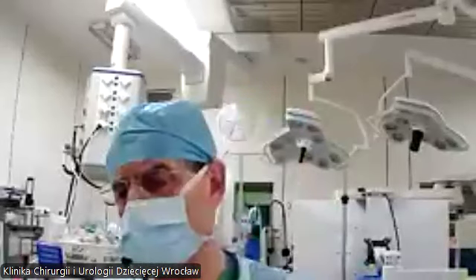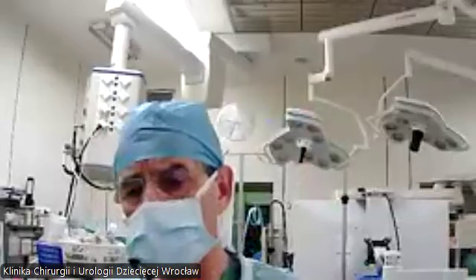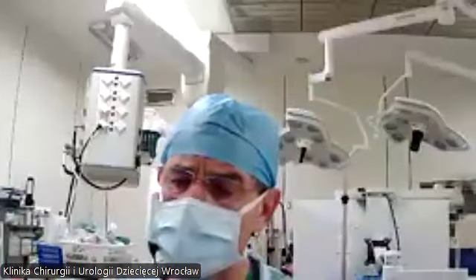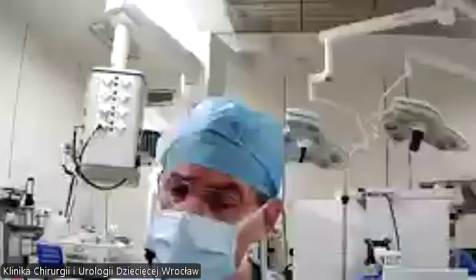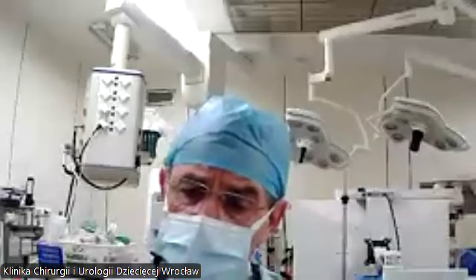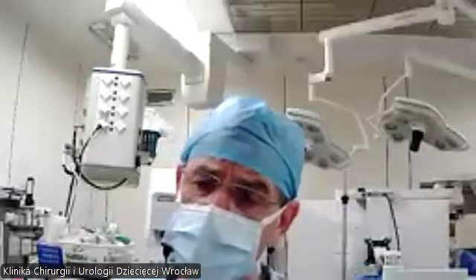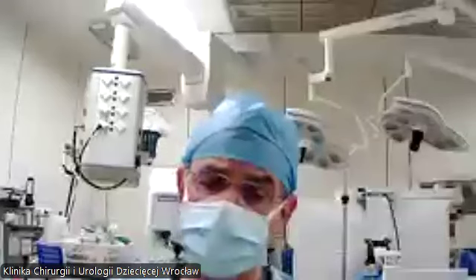The position, as I explained at the beginning, is the way we put the trocars. The trocars are placed around the scapula, so this is our anatomic landmark. The first one is at the posterior axillary line, about 1 centimeter below the tip of the scapula. The second one is at the same level, halfway between the vertebra and the first one. And the third one is at the axillary fossa, also in the posterior axillary line. It's very important how you place this trocar. You have to go under the skin, then under the scapula, take your trocar with the scapula up, and then enter the chest. This is just a trick to have good access.